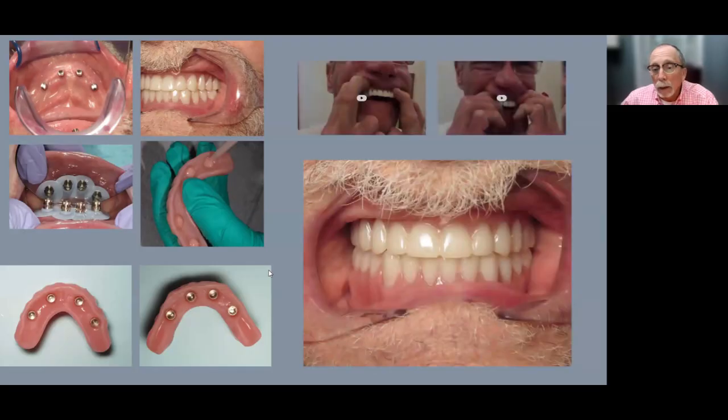Now, I'm going to show you these videos of this guy. This was a case we did with a doc in Georgia, and this guy was a farmer figuring stuff out, no problem, right? He understood it and was not afraid. And so when you deliver these things like you do with locators, you wonder, right? Can you get it out, right? So we tell him, put it in. We need to see you get it out 4 or 5 times. And so this first try, we explain what we did.